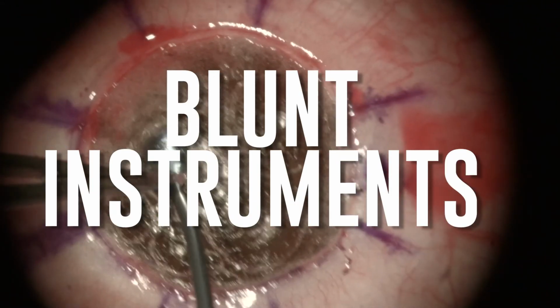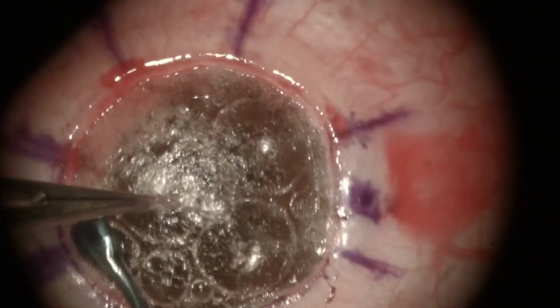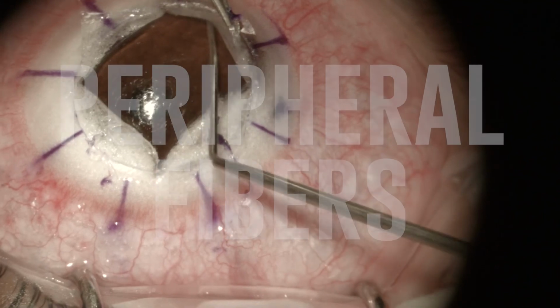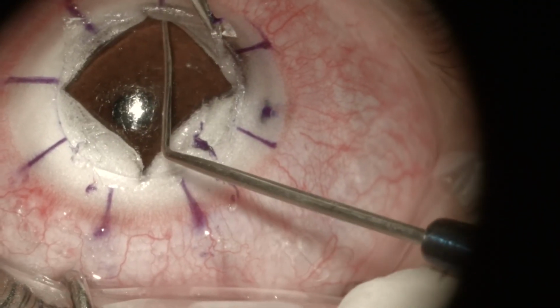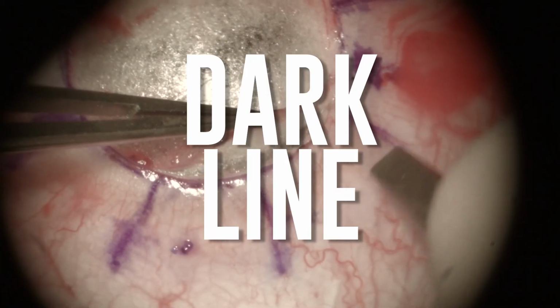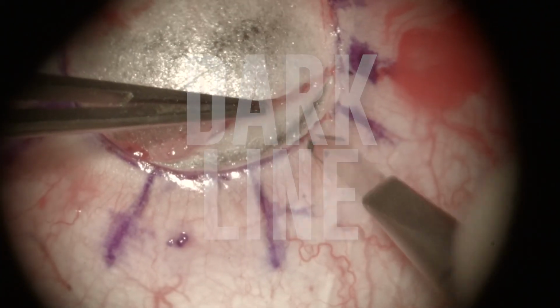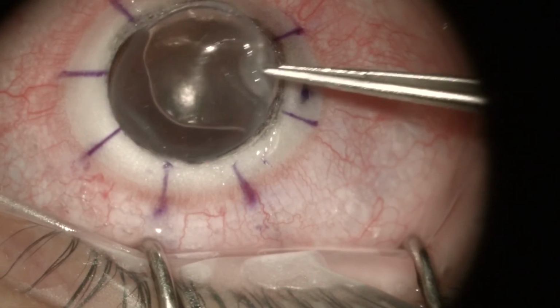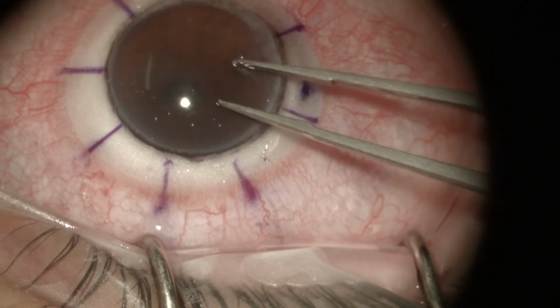Always use blunt instruments like the Fogla glass dissector. Dissect peripheral fibers between the Descemet layer and the stroma with the Barraquer spatula, pushing the stromal side. In manual technique, vertical incision, and find the dark line. All these tips will make your DALK a little bit easier, mostly if you are beginning with this procedure.